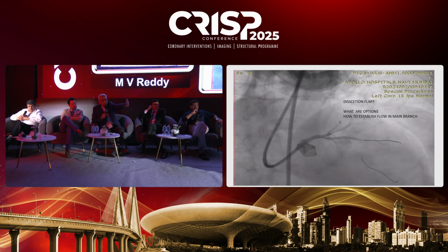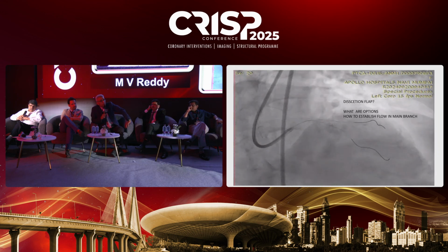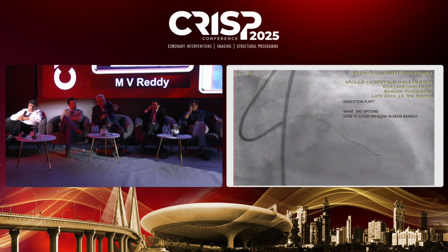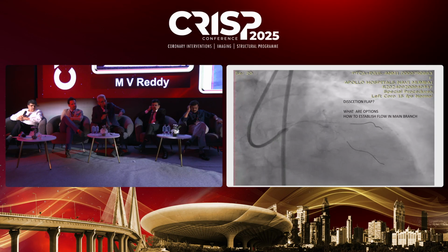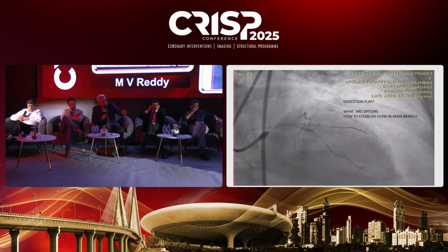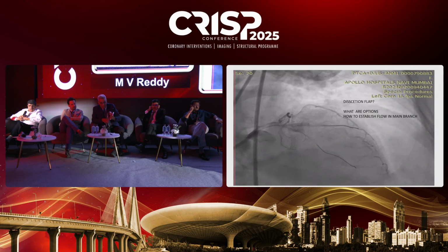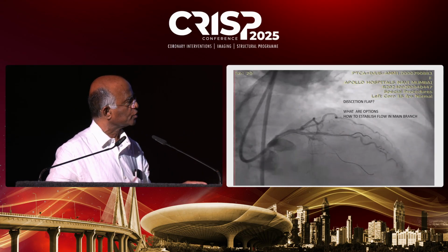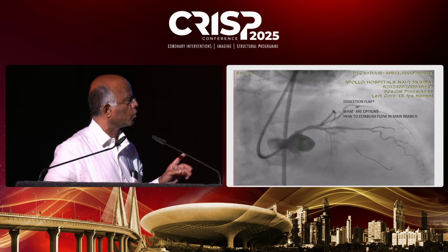No, he's got a point, because if there is a dissection flap, you could continue to expand the dissection. So imagine the roles reversed. Imagine this had been the LAD and you had lost a large diagonal and you wanted to salvage it. You could probably use the same wire, go under the stent with a microcatheter and salvage it. I understand. But see, the patient is symptomatic, hypotensive, with chest pain, you can't keep on pedaling, no? You have to establish the flow.